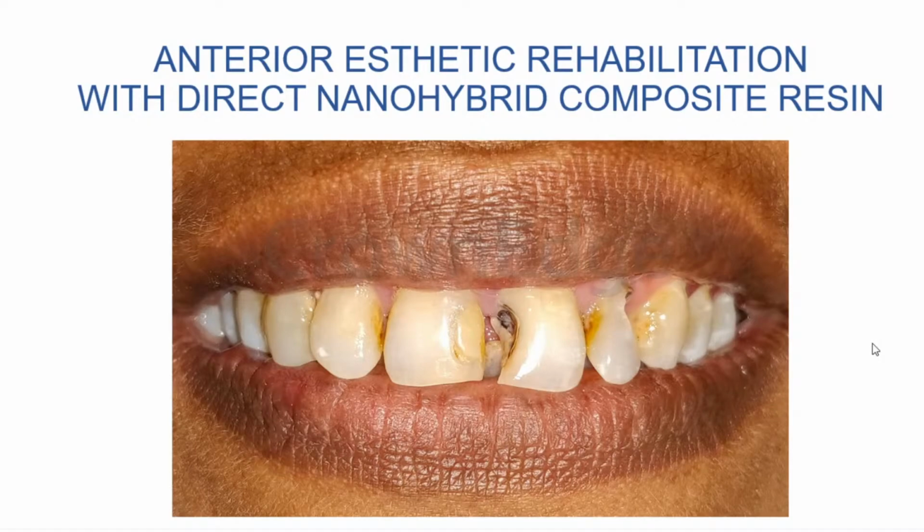So you can see that the patient has an old composite filling in the mesial aspect. That is a class 3 mesial composite resin, which has been extended over the facial aspect. There's also a restoration that has been dislodged with respect to 2-1 and also 2-2. So I'll show you the different views of the same.